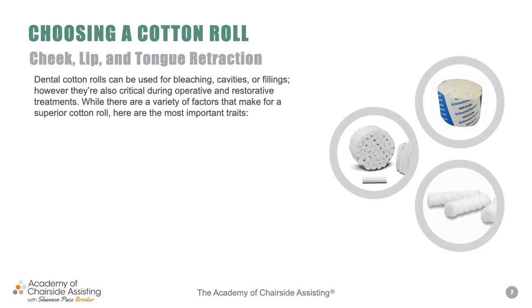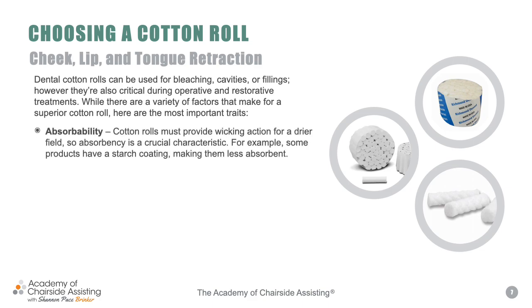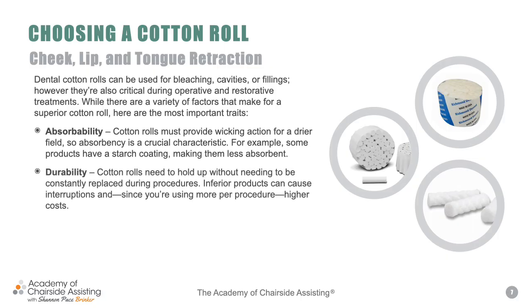There's all different types and brands, and I have my preference. As a dental assistant, you will have yours as well. But the most important thing you want to look at is absorbency, and there's so many different brands. I here have Richmond Dental cotton rolls. I really do love utilizing their products. There's a lot of other ones out there. This one is just tried and true to me, and I love the fact that it's family owned and operated, very durable, and different types here.